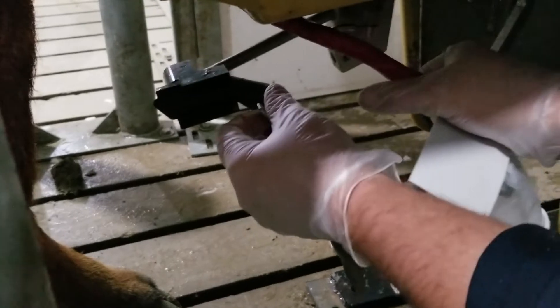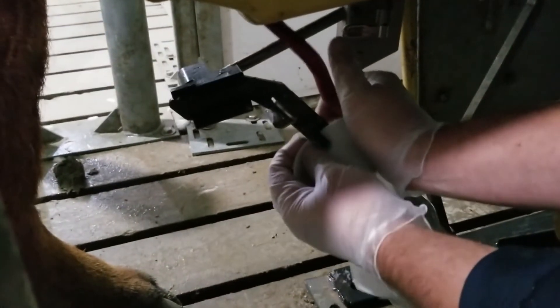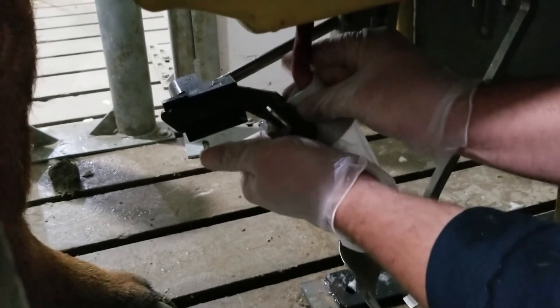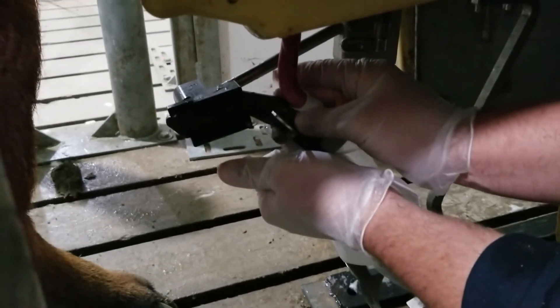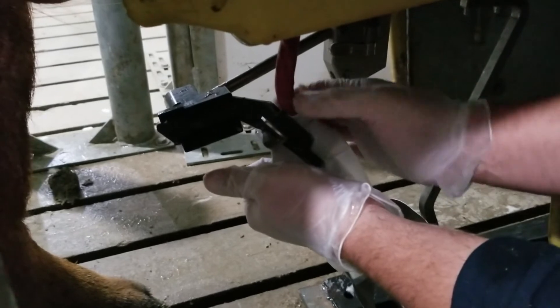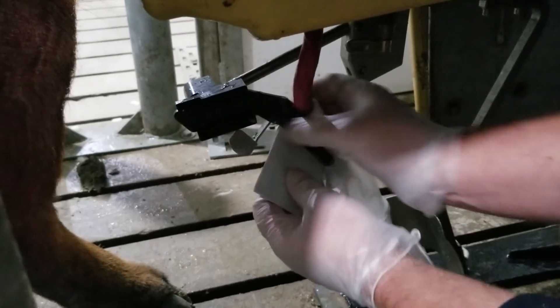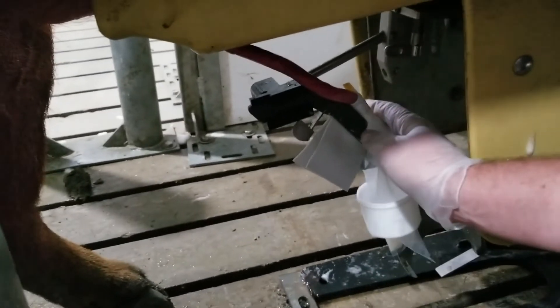I'm going to grab the slide, bring that forward. I'm going to take the ears of the AC and slide that up into the clamp and pull down on it. Now when I pull down on those ears I can release my hands and push the trigger down so it's about even. And now he's locked in.